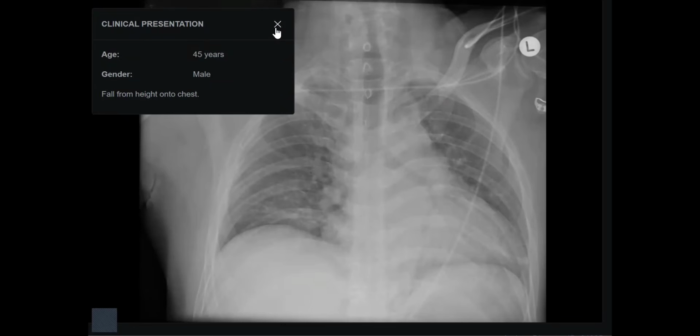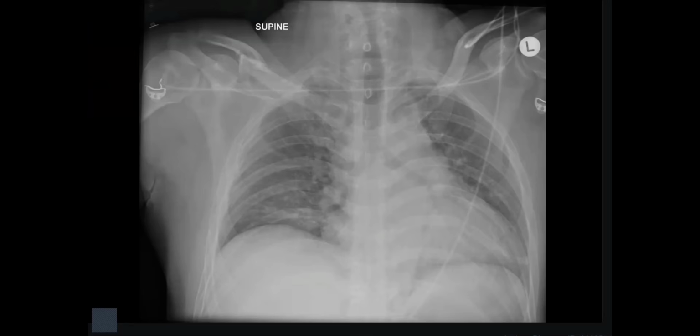Okay, another case. Next candidate. Yes, sir. Okay, how are you, my friend? I'm good, sir. Okay, I'll give you the control, but now this is a case of trauma, fall from height.